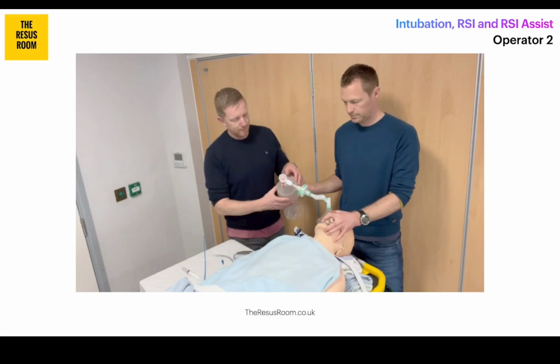Now, you've seen this video before, but let's look at it now from the Operator 2 perspective. And in this case, Simon is performing that role. He's standing on the right-hand side of the patient along with the kit dump. Now, hopefully I've chosen the right person for the job, because to do this well, he needs to understand the airway anatomy and the process of intubation so he can provide essential input to my efforts. He's going to be observing, anticipating, planning, prompting and guiding. And on top of all of that, he's going to be maintaining a wider awareness of the situation, while I am very much task focused with the technical skill involved in the intubation.